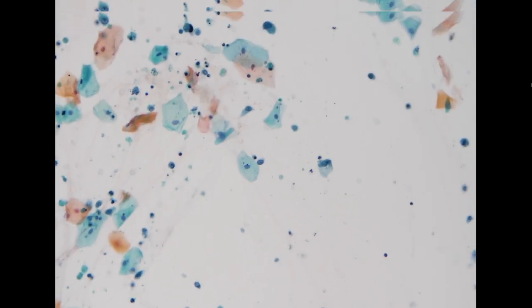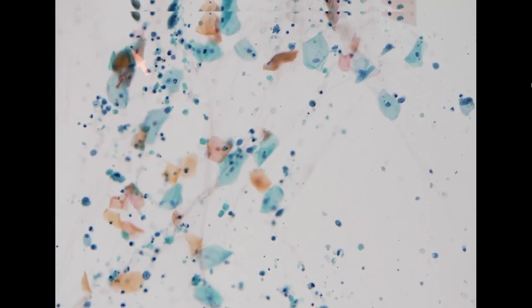So the next case is coming from a 69-year-old male. This is his voided urine specimen that we received a few weeks ago. On low power, we do not see nicely preserved cells. Here we have some intermediate cells, and then we have some superficial cells, but this is a male, so this is likely coming from the urethra or the external meatus.